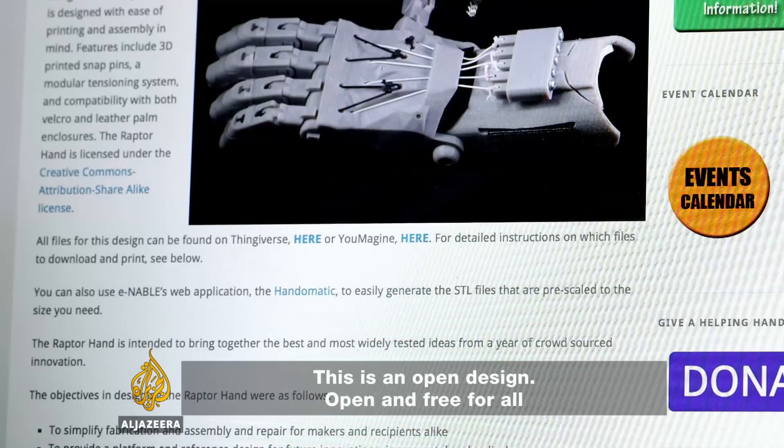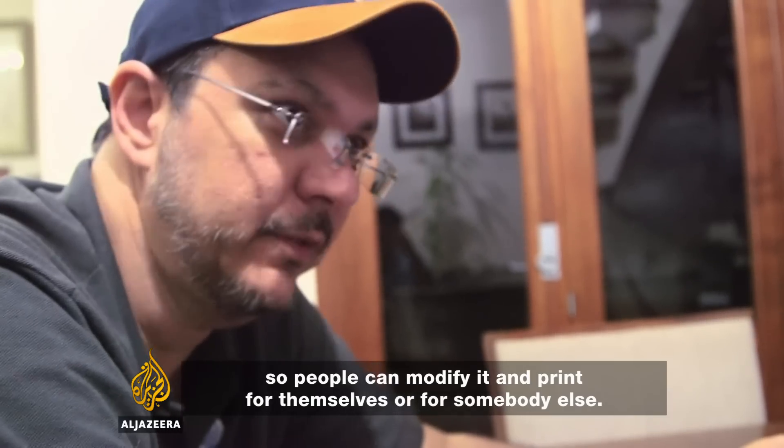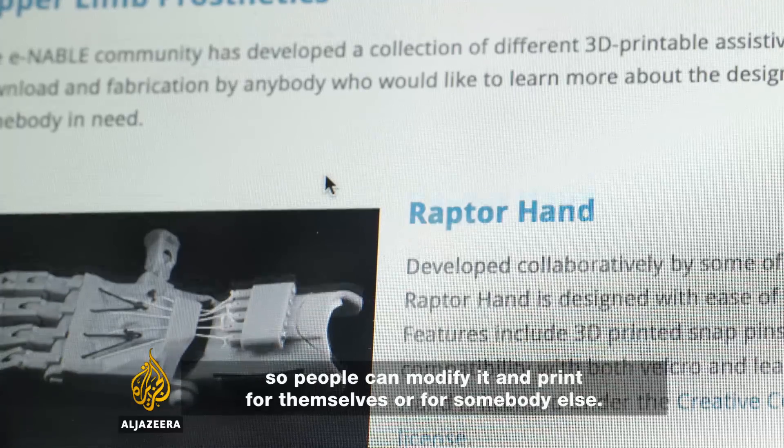This design is open — it is free and open. So people can modify it and print it for themselves or for other people.